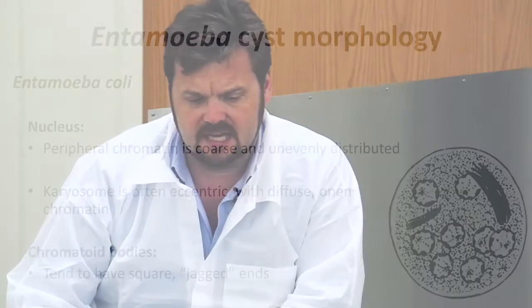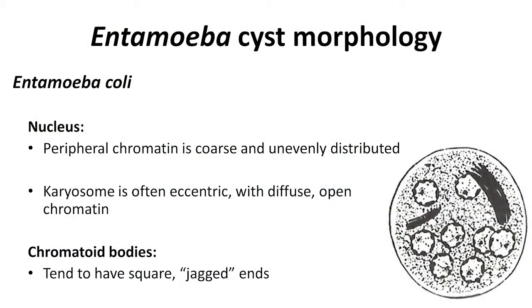The karyosome is eccentric, so it's not absolutely in the center of the nucleus. And it's a little bit bigger and more diffuse than you would expect to see in an Entamoeba histolytica. Finally, these chromatoid bodies have jagged ends or pointy ends such as this, quite different to those which you see in Entamoeba histolytica complex. So those are the major morphological features of the cysts that differentiate them.